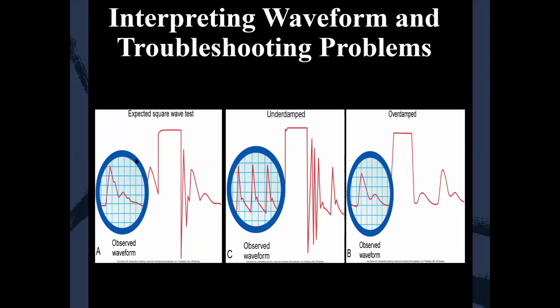All right, so let's go over this again then, since you couldn't see my cursor. It's anticipated to have this beautiful square waveform with a few oscillations. Do you see that? That's expected. So I pull that little blue pigtail, I stop the waveform because I'm flushing the line very fast, and then I let go, and it oscillates. Boom, boom, boom, boom, boom. That's expected. Underdamped, too many oscillations. You see that craziness right here? Too many oscillations. It's overestimating the patient's systolic blood pressure.